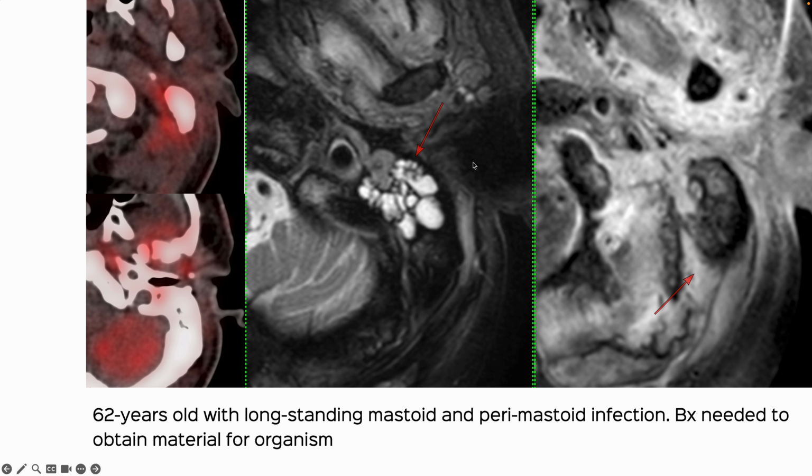And this was interesting. Here's a patient who's had a long standing infection that's not coming under control, so the infectious disease physician wanted a re-look at the entire process. On the MR, there's fluid in the mastoid and soft tissue around the mastoid process, and the PET didn't show any uptake in the mastoid cells, but does show perimastoid soft tissue. And actually, this is quite easy.